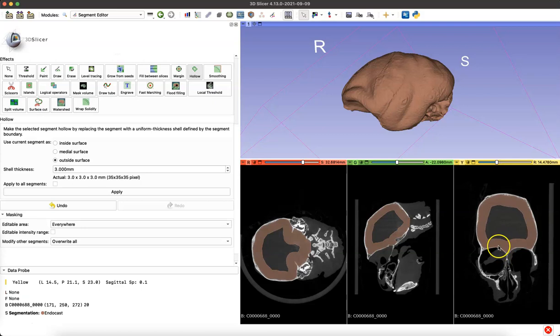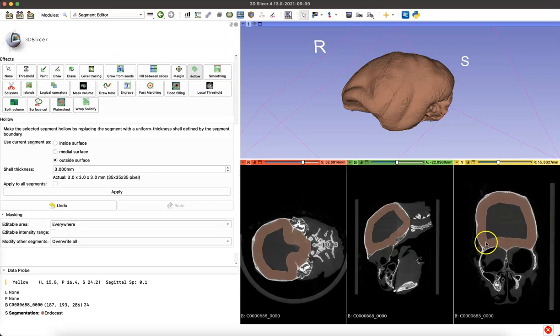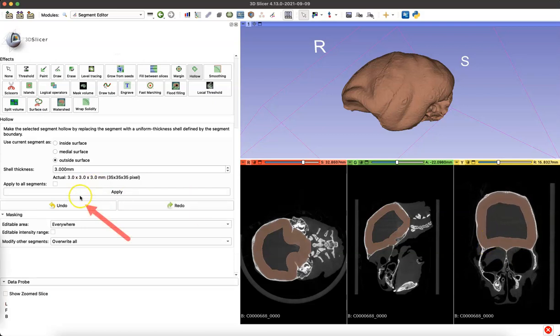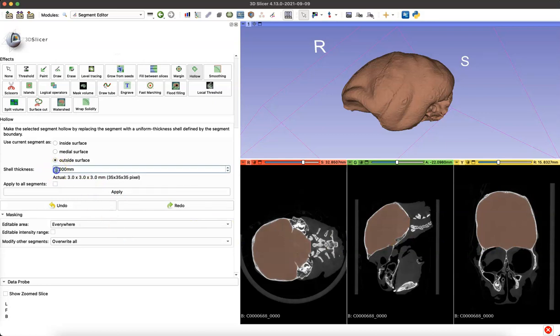You can easily adjust it by just going over to your left hand menu, clicking undo, adjusting your shell thickness, and then clicking apply again.